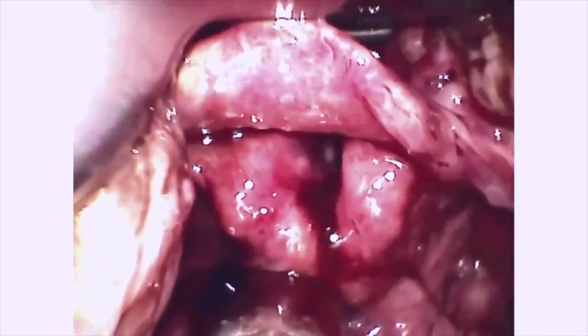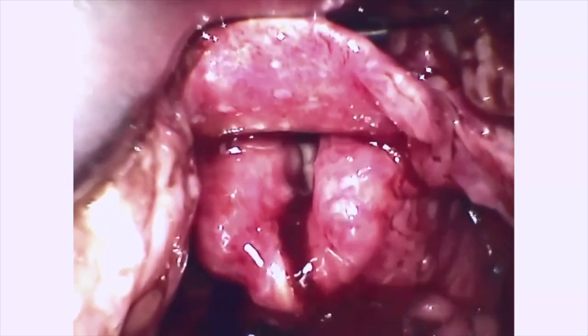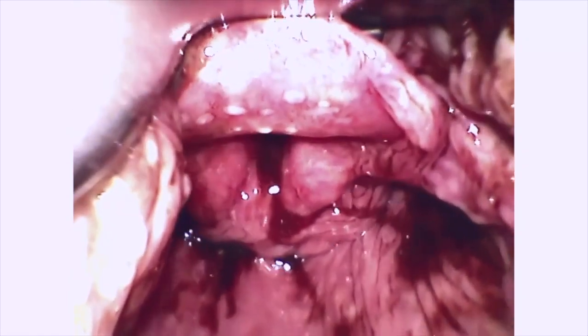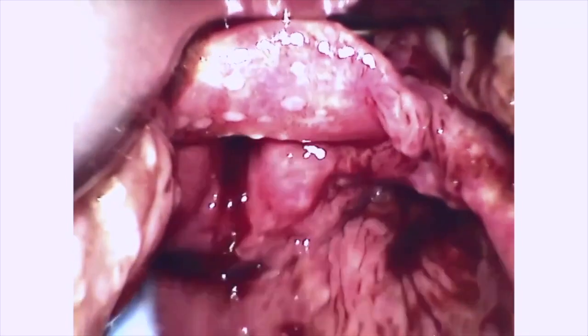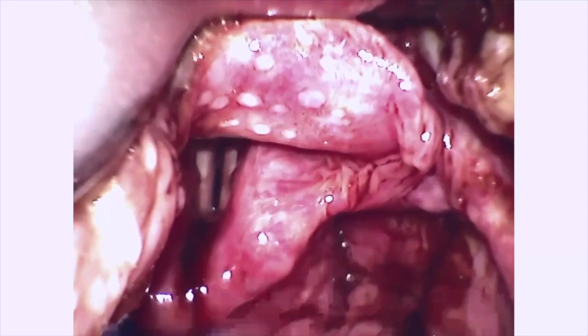So of course, that's a great opportunity for the bougie, right? We can actually bend the bougie more anterior to really get in there. But it's identifying that the curvature of our stylet is not going to match the geometry of the airway, right? Identifying that early and then switching over to the bougie.